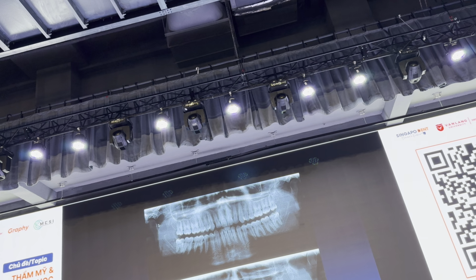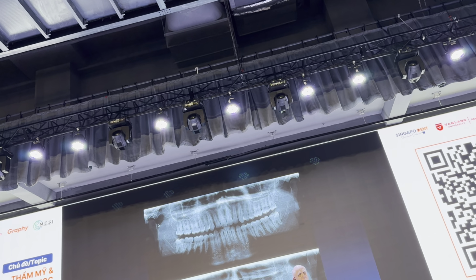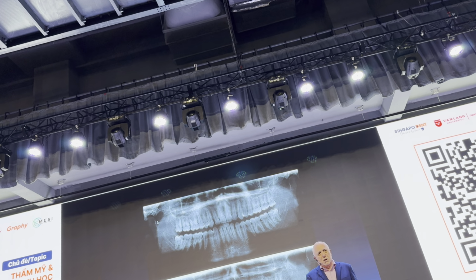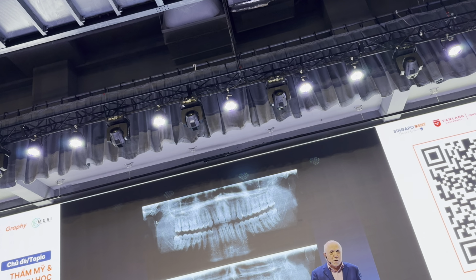And one of the things I always teach is don't take panoramic film at the end of the treatment. Take panoramic film 3 to 4 months before you think you are done.